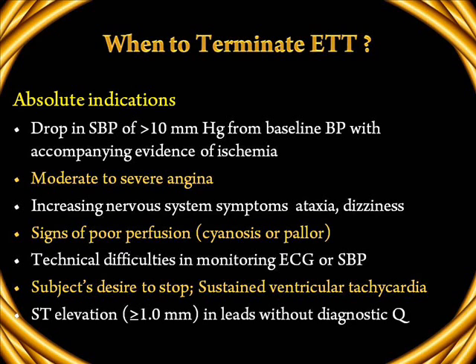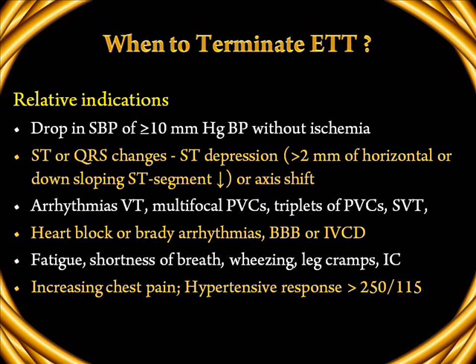whenever he wants. Sustained ventricular tachycardias and arrhythmias, ST elevation of more than 1 millimeter in leads without diagnostic Q-waves are also absolute indications to terminate exercise testing prematurely. Here are some of the relative indications for terminating the exercise test. A drop in systolic blood pressure of more than 10 millimeters without evidence of ischemia on the ECG monitor.